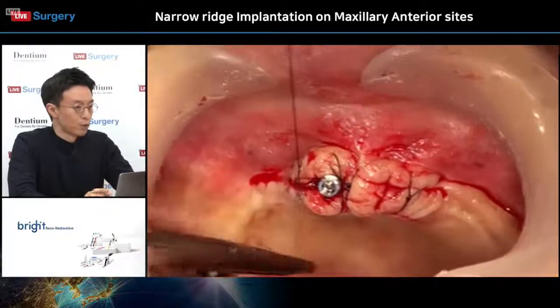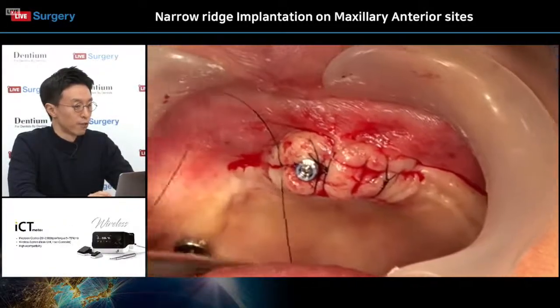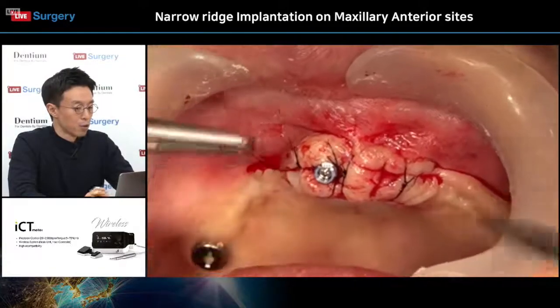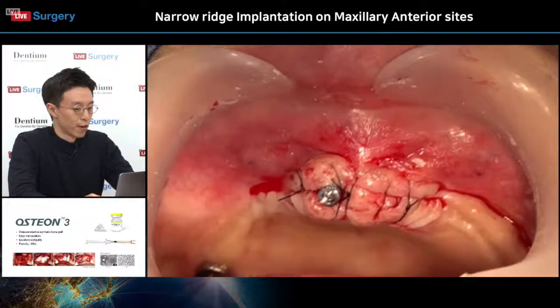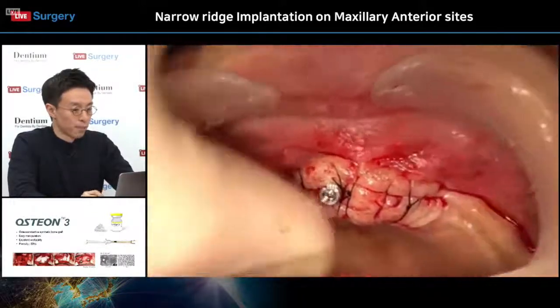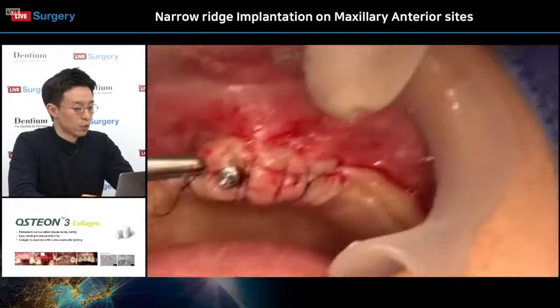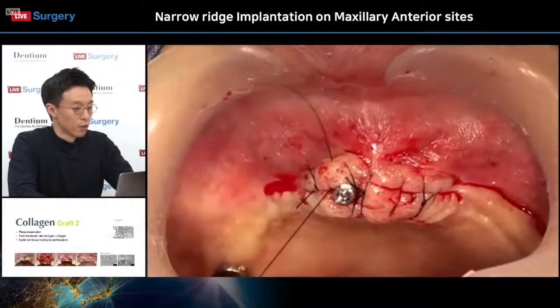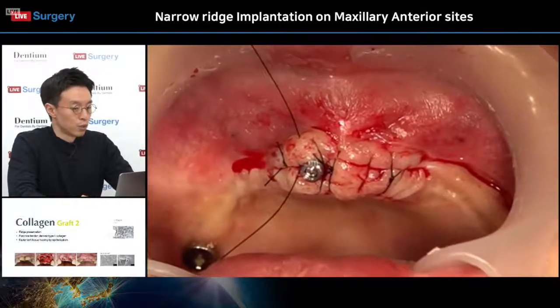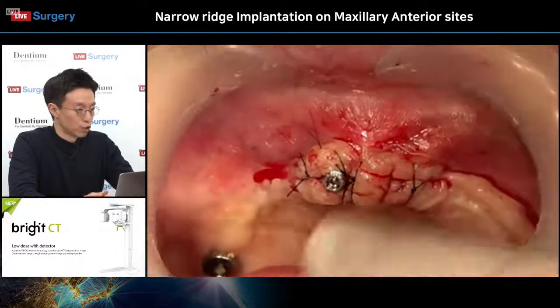One thing you have to be careful of is when you are restoring the frenum. You can prevent the adhesions of the buccal and labial frenum by restoring them with key sutures that don't allow a lot of movement. This is the area where you have to use the most reliable suture, such as the horizontal mattress suture.